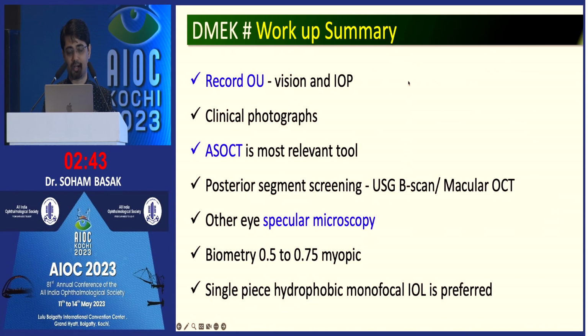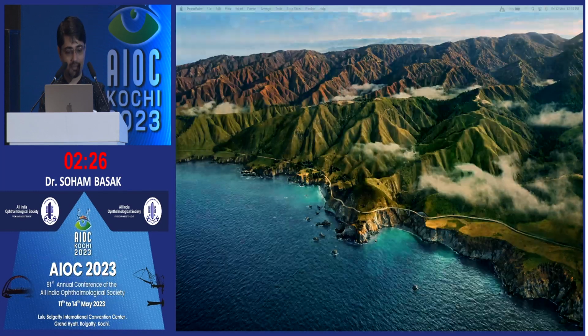So to summarize this, definitely record both vision and intraocular pressure. Anterior segment OCT is the most relevant tool, along with specular microscopy of the other eye. Go for a single piece hydrophobic monofocal IOL with a 0.5 to 0.75 myopic target. Thank you very much.